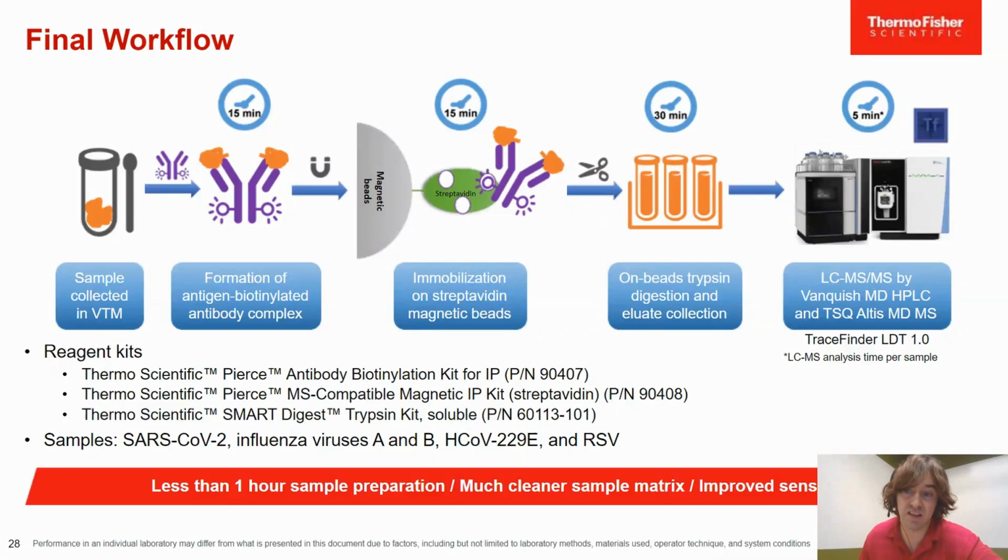The antigen biotinylated antibody complexes were then immobilized on streptavidin magnetic beads and separated from the solution with a magnet. After several wash steps, the antigen antibody complex was digested by trypsin while still attached to the beads. This resulted in the release of the majority of the peptides from the complex, including the peptide targets for each of the viruses, which were then analyzed by an LC-MS method.